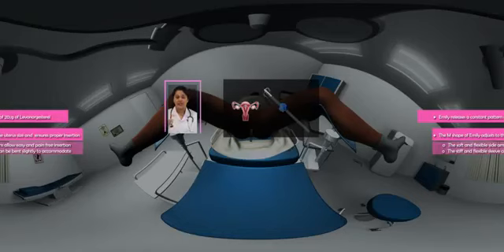The soft and flexible side arms allow easy and pain-free insertion. The stiff and flexible sleeve can be bent slightly to accommodate. The insertion and removal of EMILY is very simple and can be performed in a few minutes.